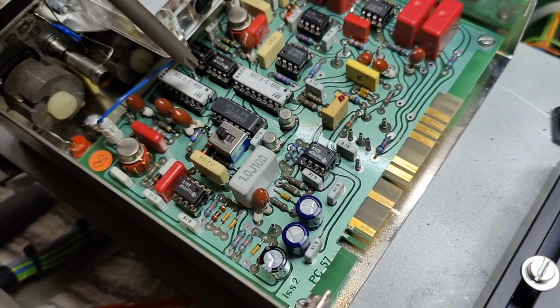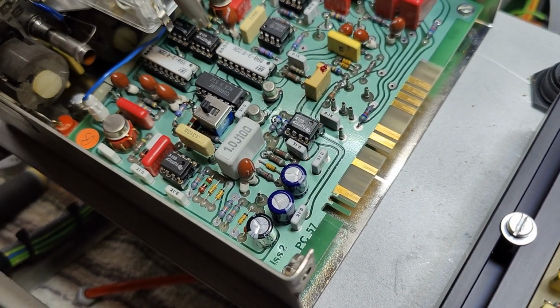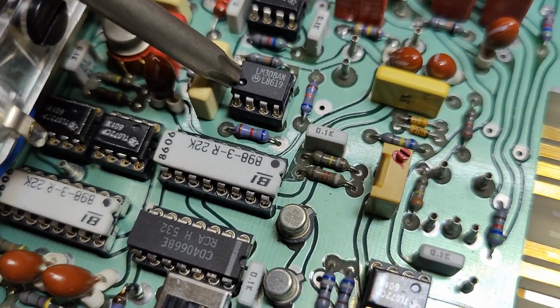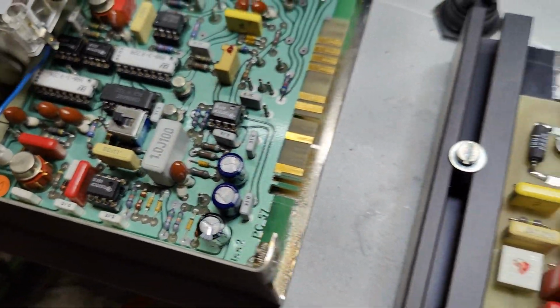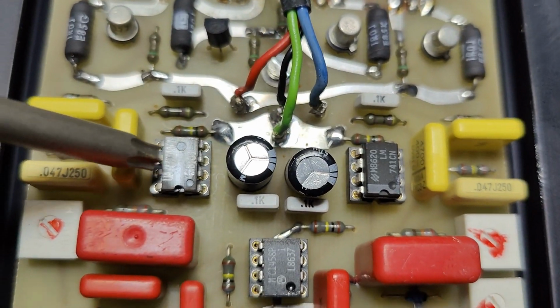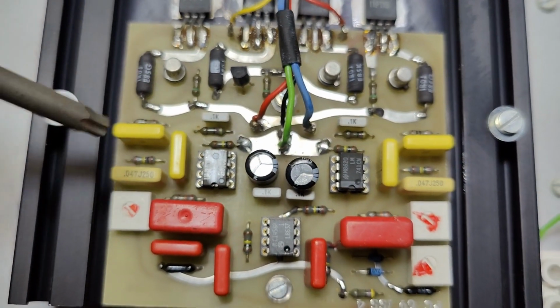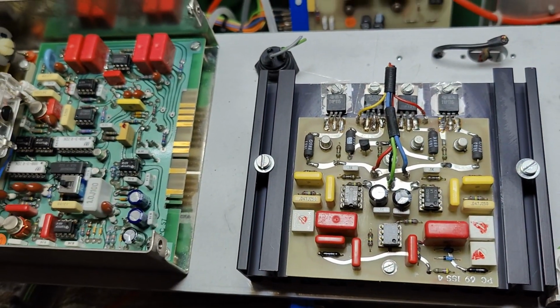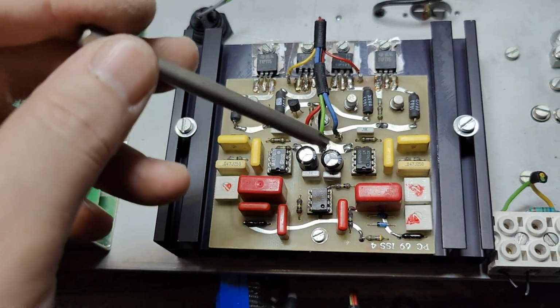I also found most of the ICs with the date codes, they are 86. So most of them say 86. This one, many of them say 86, and it's the same over here. We got a few of them much older, but that's probably just old stock they are reusing when they manufacture this. So I always date them after the newest of them, right?